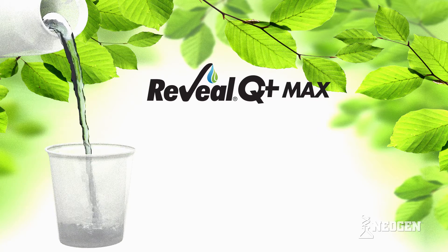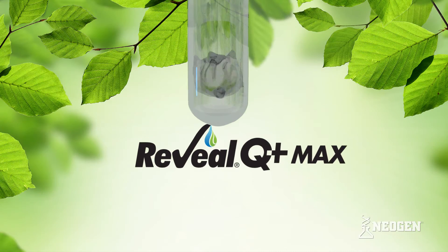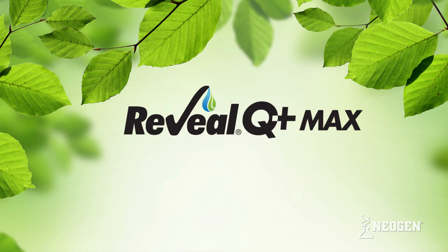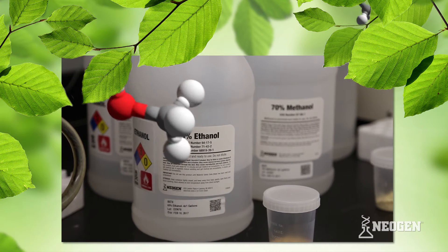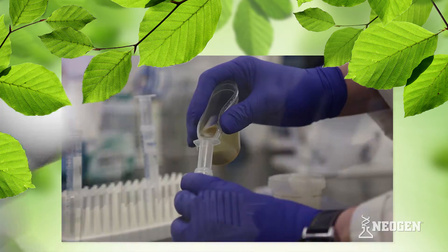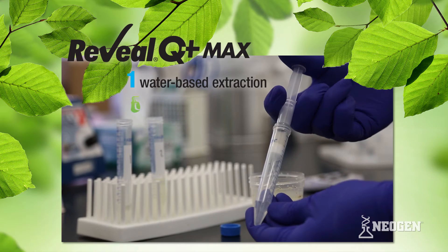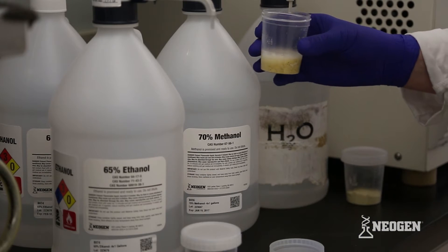Neogen's Reveal Q Plus Max mycotoxin tests provide precise, reproducible results using a single common water-based extraction. Reveal Q Plus Max tests eliminate the need for using hazardous materials to extract toxins from your sample, and make it possible to use the same sample extract to test for up to six different mycotoxins.